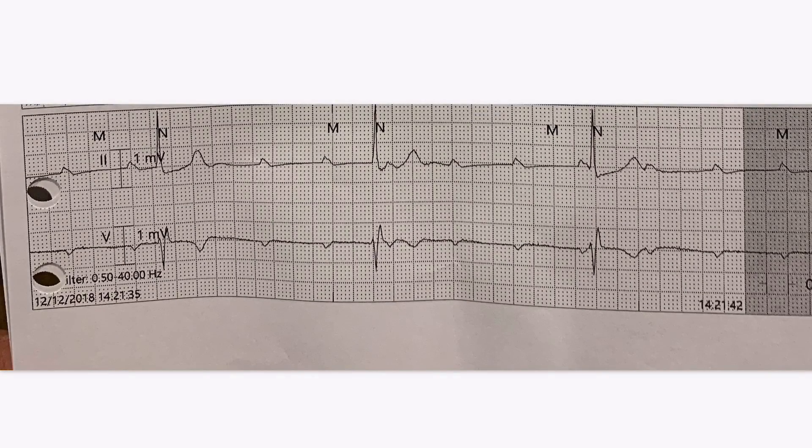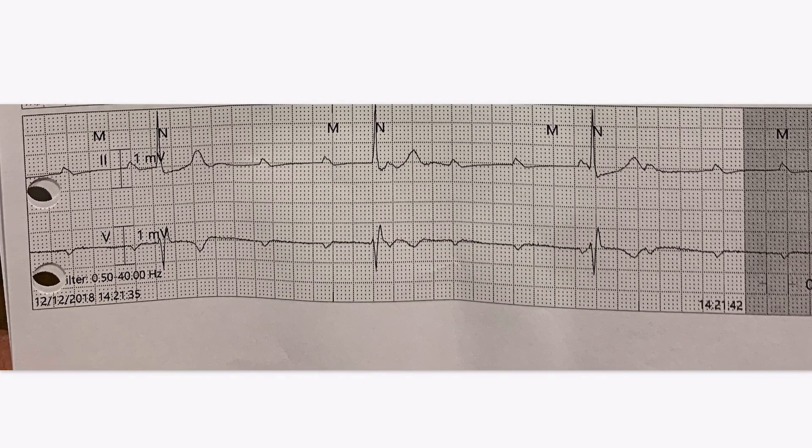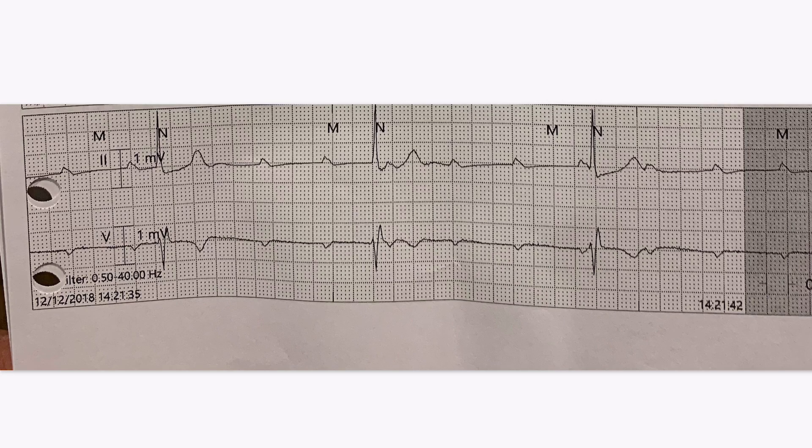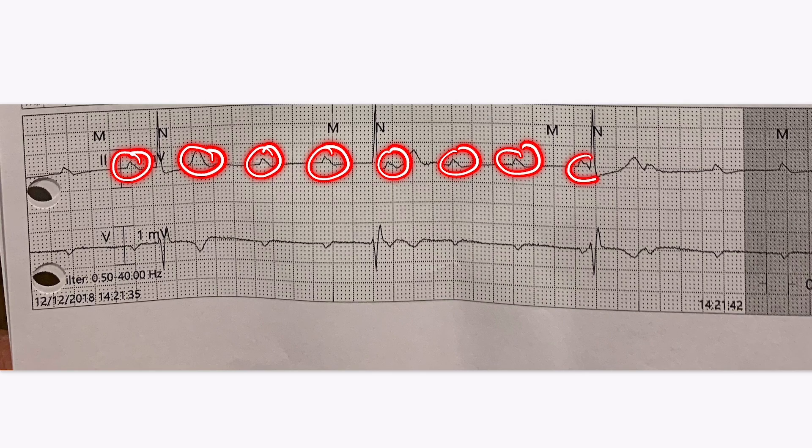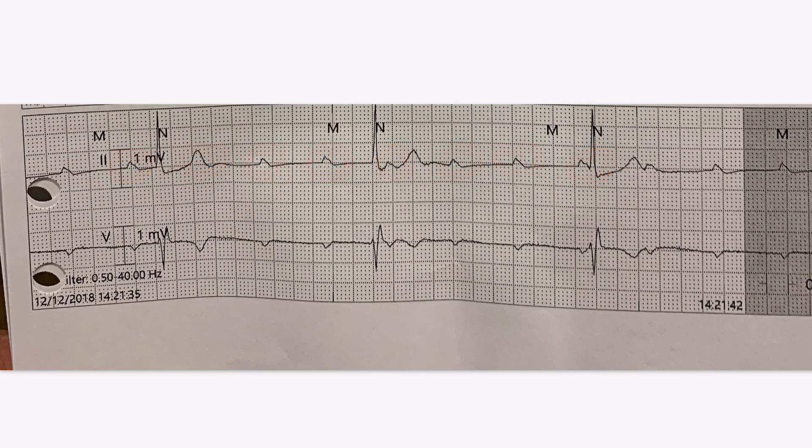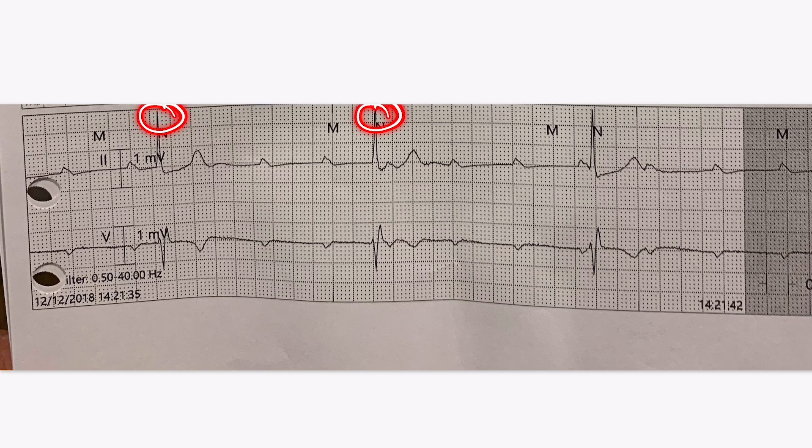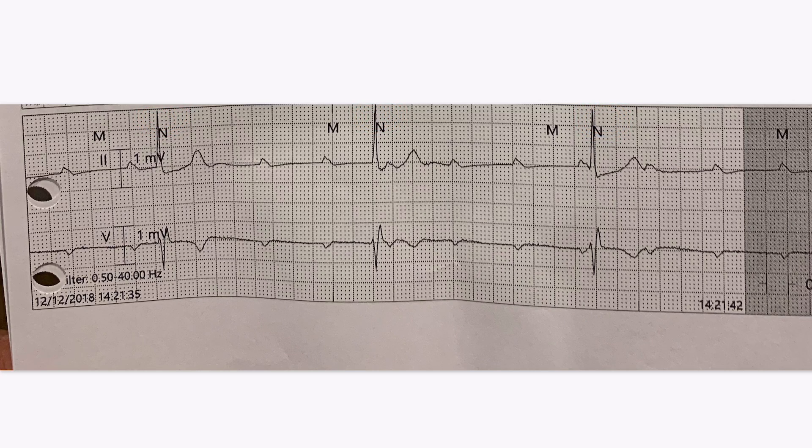We're going to go through a quick example here. Here's a rhythm strip, and we're going to figure out what the type of block is here. First thing to do, identify the P-waves. So we see P-waves here. Here's one on the T-wave, and there are P-waves that are just marching through here. And obviously there's a lot less QRS. So there's more P-waves than QRS, already indicative of some sort of block.